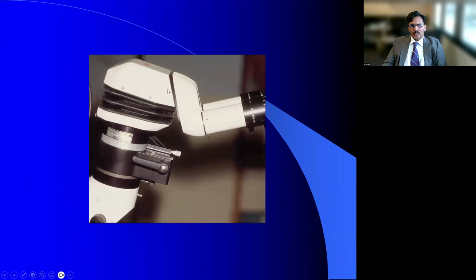And again, it has to be housed between the examiner or the surgeon and the microscope, and it's usually made so that it is easy to assemble as well as disassemble, just with a screw.